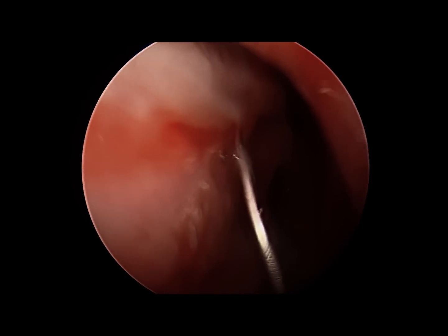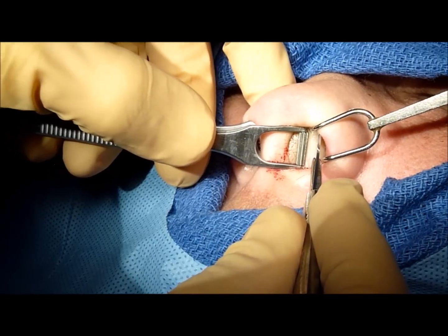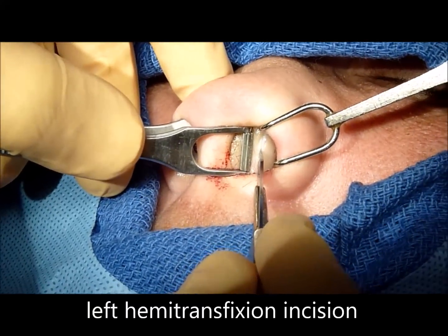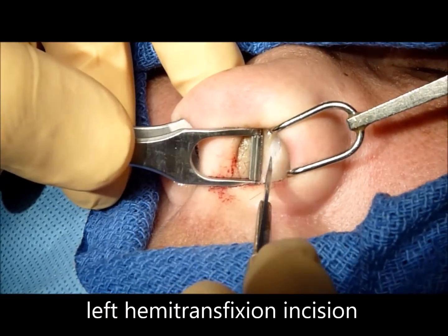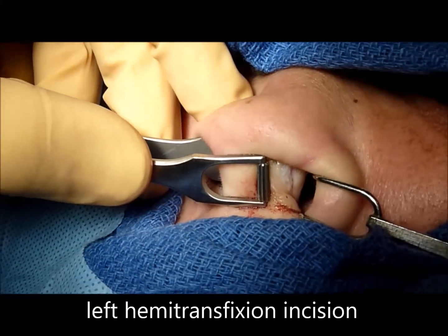The incision for the septoplasty will be made 2 to 3 millimeters lateral to the free edge of the caudal aspect of the septum, and this allows us to then identify the proper submucoperichondrial plane to then elevate the mucosa carefully to allow us to insert a speculum.